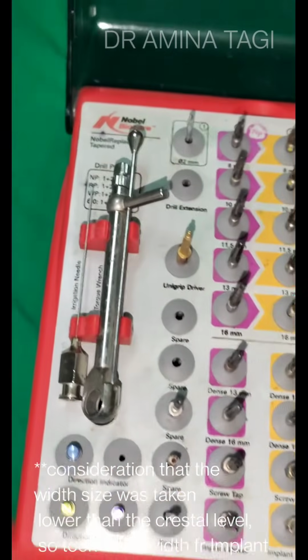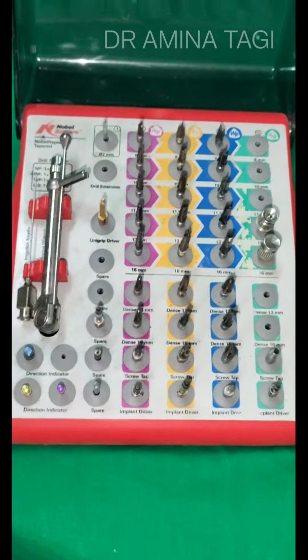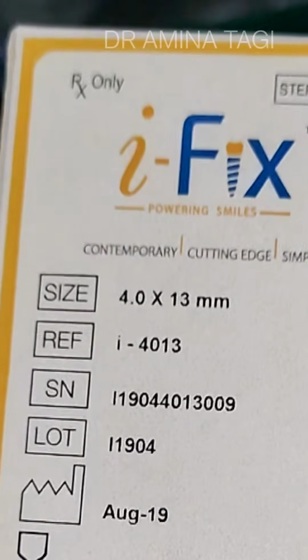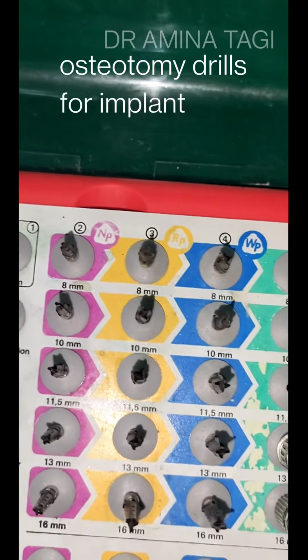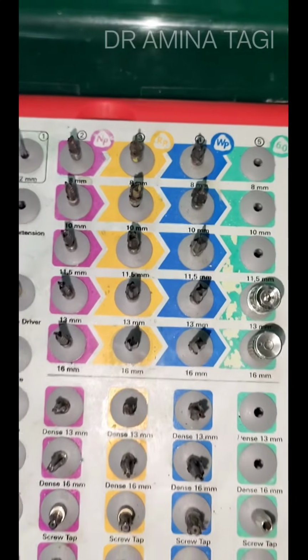I had planned for a 14 mm implant length, but since we are using the Nobel BioCare implant kit, the nearest drill length available to 14 mm is the 13 mm implant drill. So I have ultimately taken a 13 mm implant length. So you can also see the length of the drills available, that is from 8 mm till 16 mm. So it also depends on the type of the implant kit that you are going to use.